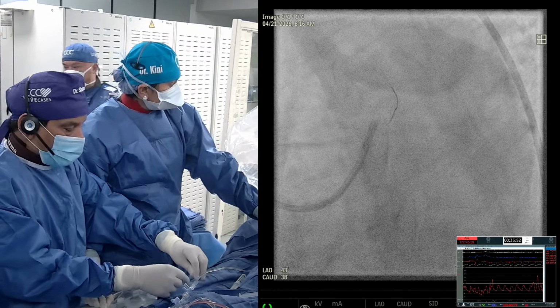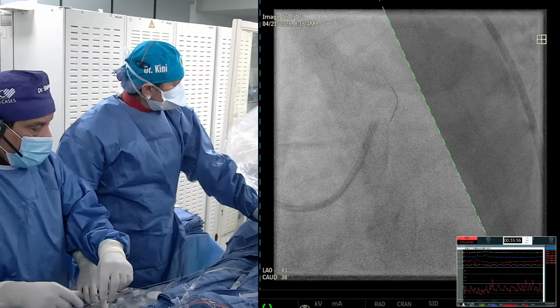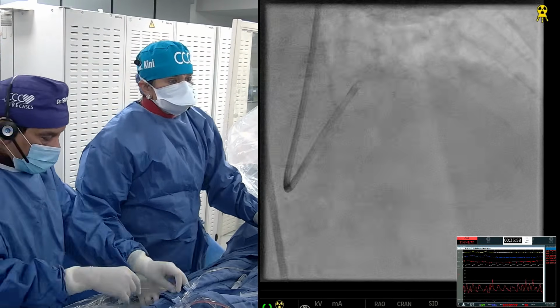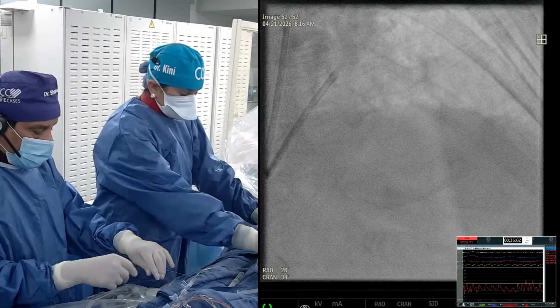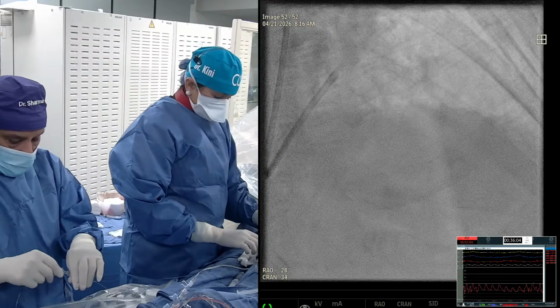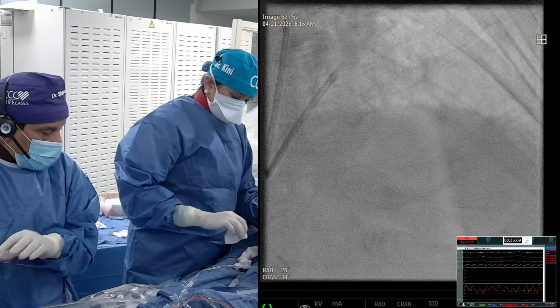Any other company that made it? The Fine Cross you had used? Yeah, we changed it to Rotawire. So now we put in a Fine Cross, cross with the Fielder, and replace it with the Rota, all in 18 seconds. Unbelievable.